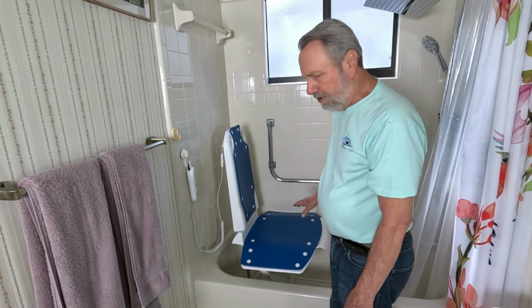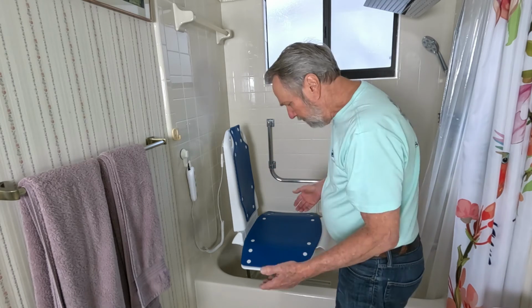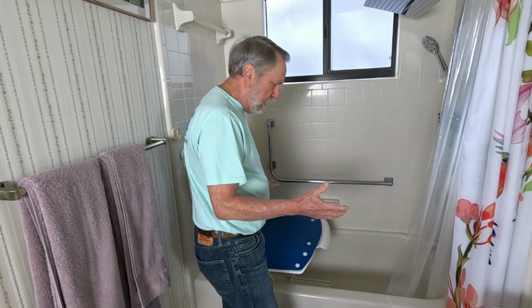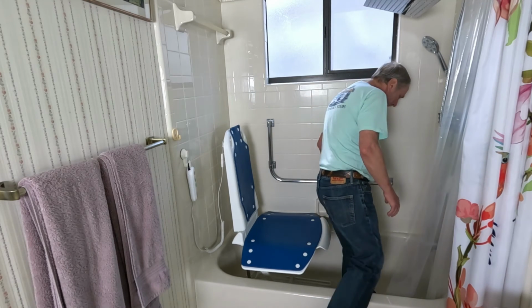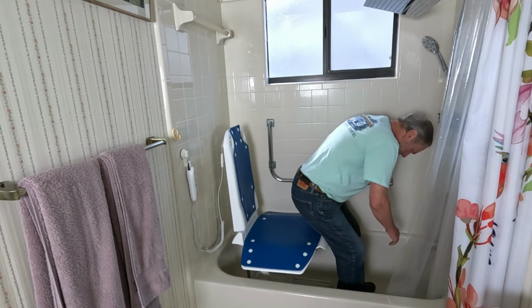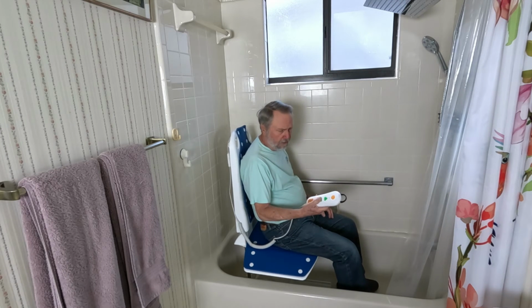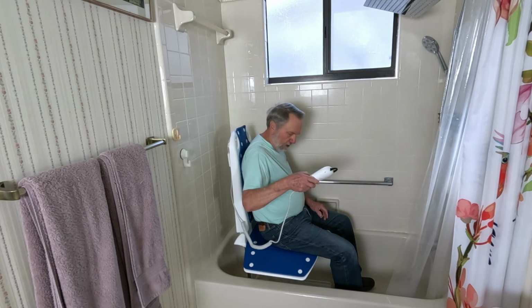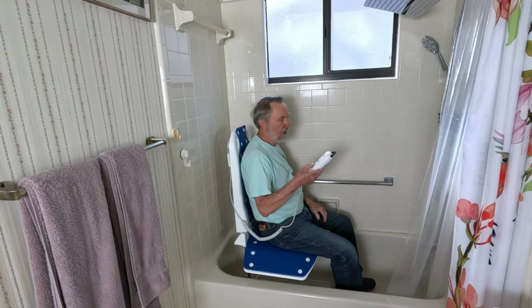All right, now we're going to demonstrate how this will work. The person's ready for bath. They can come over, and the chair is all ready to go. They didn't have to do anything because it's set up this way. You step in, and then they can sit down. The person would take this, and we're going to go to the down position. Now I settle back, and now I'm going to lower myself down, and I'm waiting for the back to touch the wall behind me, and I know that's when I'm going to stop.